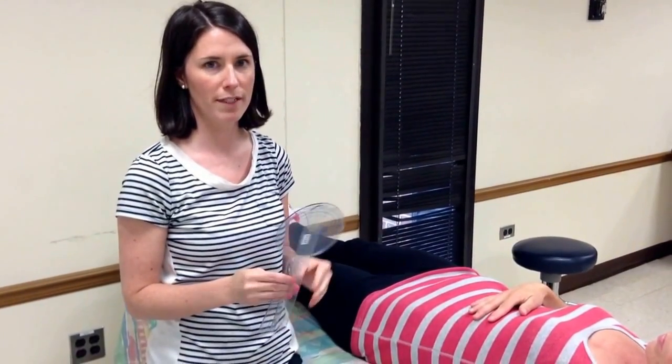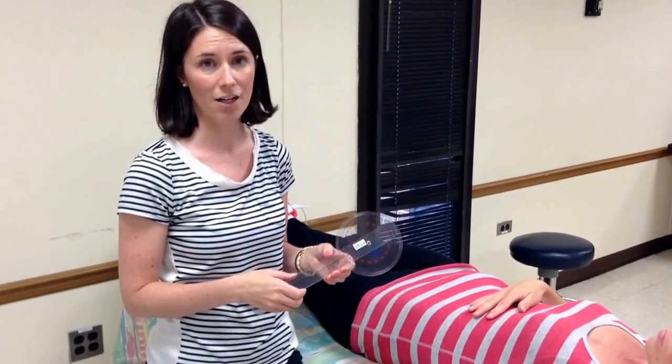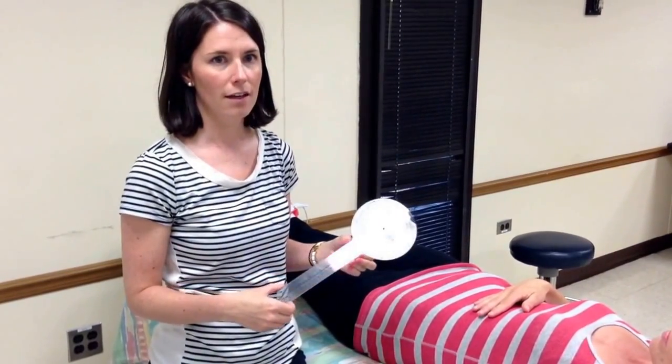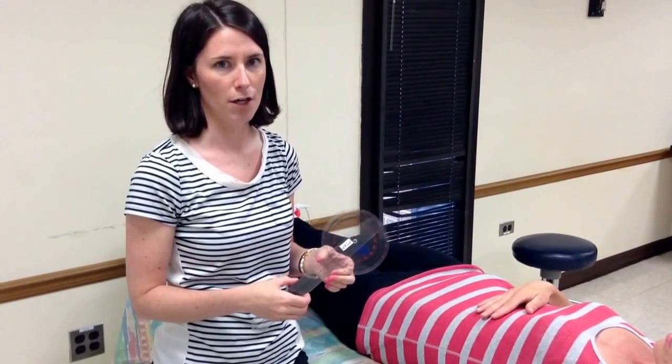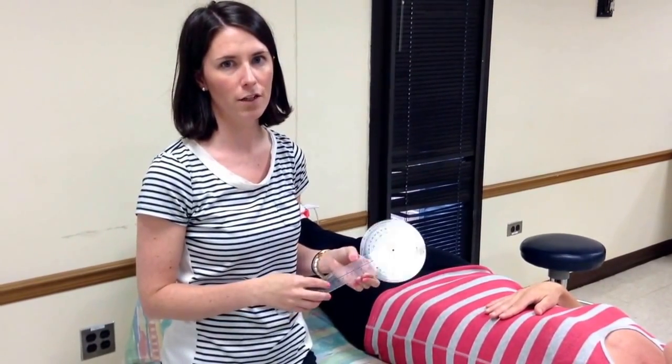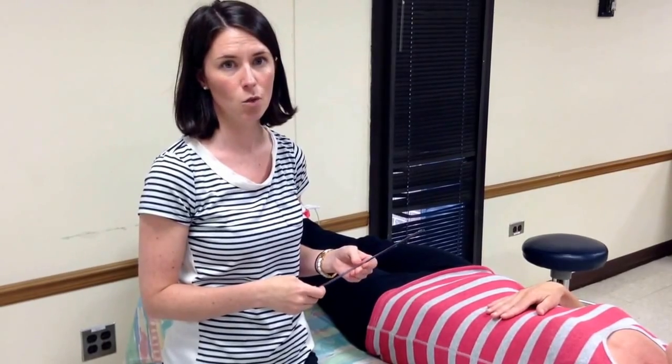This video is going to be taking range of motion measurements of hip abduction and hip adduction. Hip abduction and adduction occur in the frontal plane. The normal end feel for both is firm. The normal value for hip abduction is 40 degrees and for hip adduction is 20 degrees.